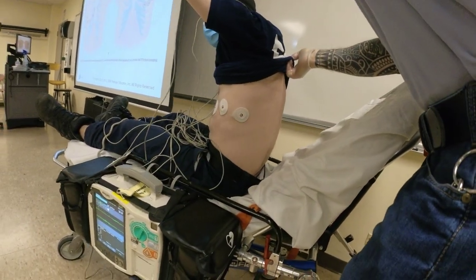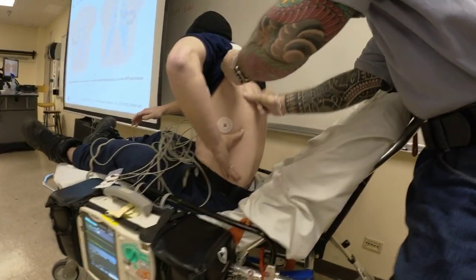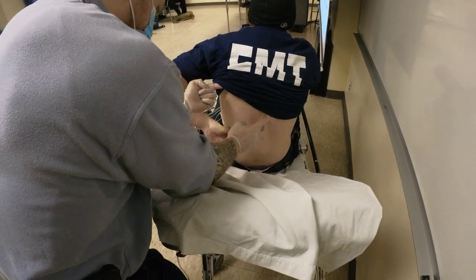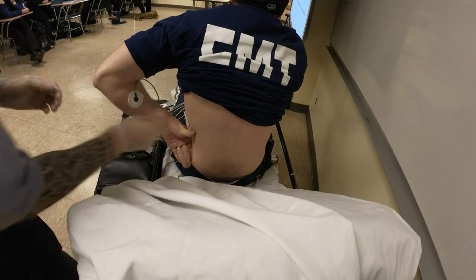Take this arm, and then move it onto your back like this. No, like towards your back. Good. Perfect. Stay like this. I'm gonna find his scapula, right? I'm gonna keep these lines on the fifth intercostal space. So, and this is his spinal. So the scapula line is gonna be V8 and this is gonna be V9. So I prep the skin.